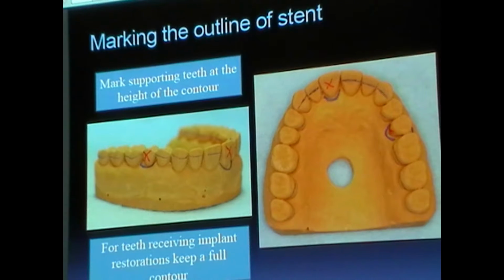You notice that you need a cast where you're going to create that cylindrical hole in the center, which you will also utilize your lab cutter for. Okay?